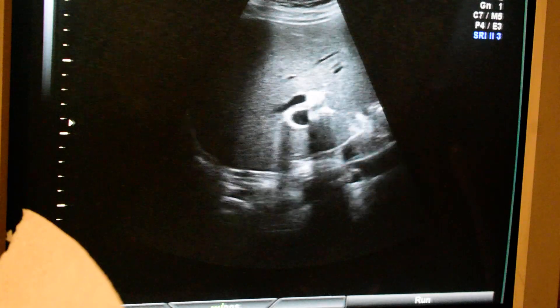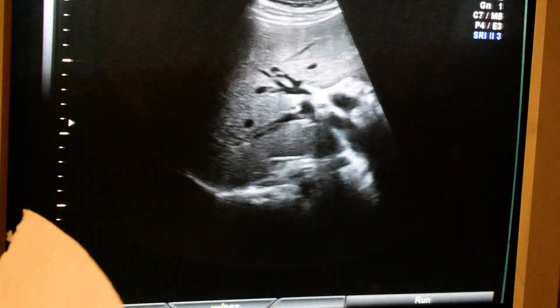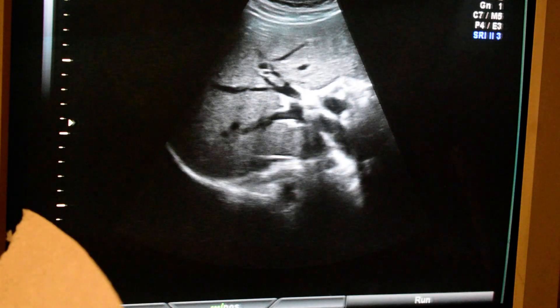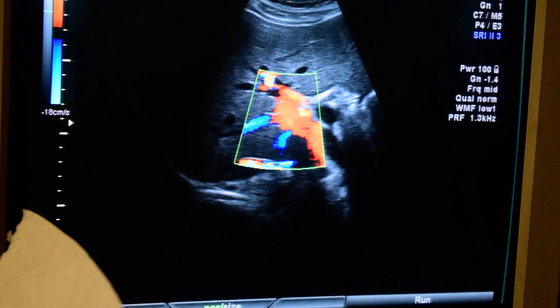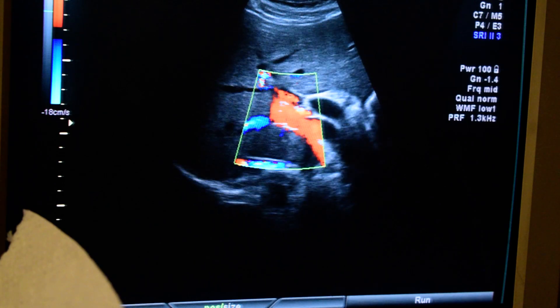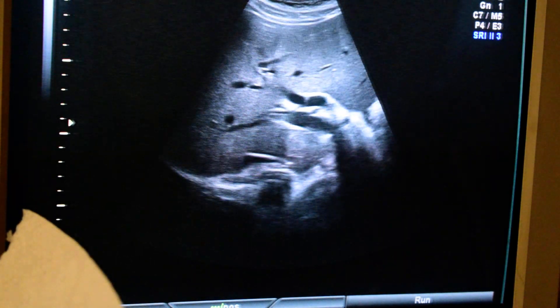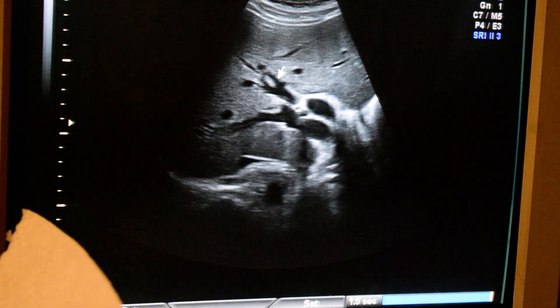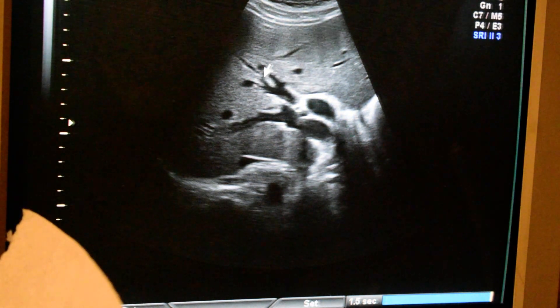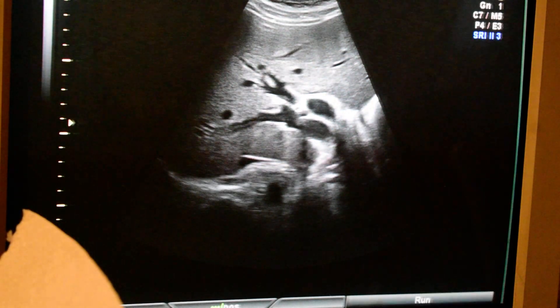There is slight dilatation of even the intrahepatic biliary ducts. You can see here the branches of the hepatic ducts. These hepatic duct branches are also dilated — normally we cannot see such branch dilatation.